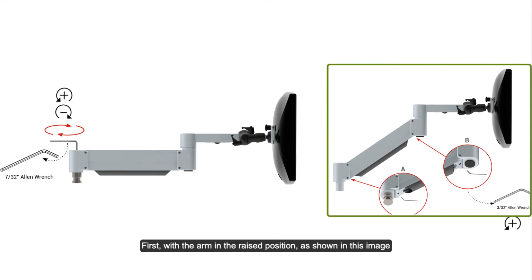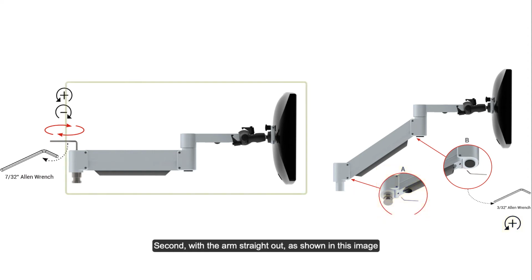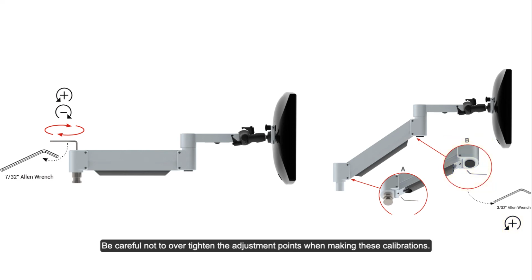First, with the arm in the raised position, as shown in this image, use the smaller Allen wrench, also included with the VarioFloat, to tighten the calibration point A by turning the Allen wrench counterclockwise. Second, with the arm straight out, as shown in this image, use the smaller Allen wrench to tighten calibration point B by turning the Allen wrench counterclockwise. Be careful not to over-tighten the adjustment points when making these calibrations.